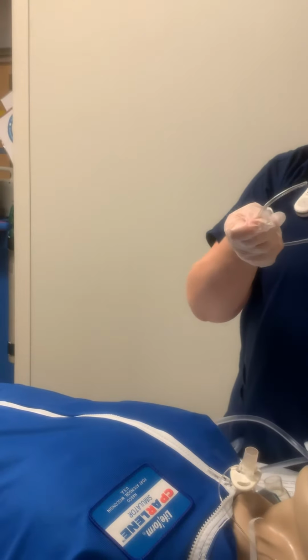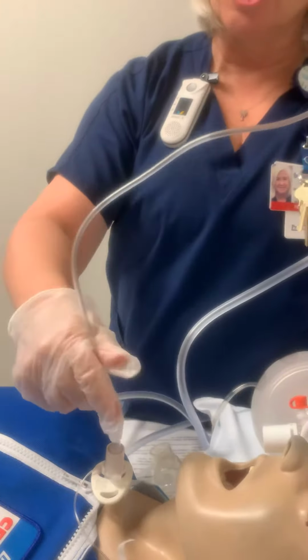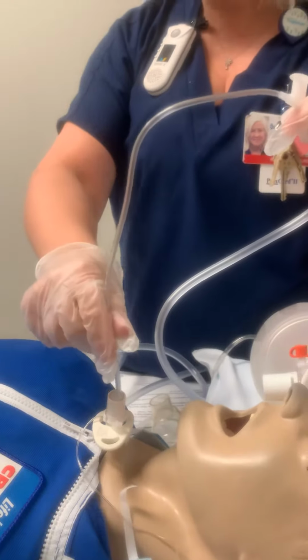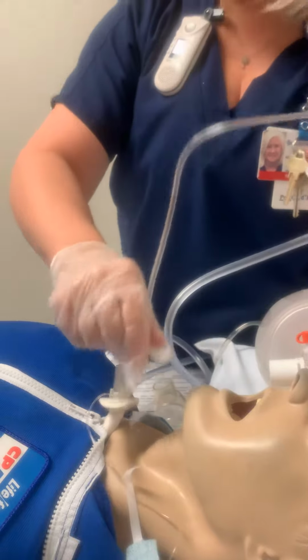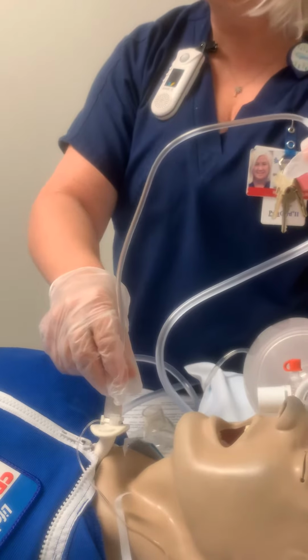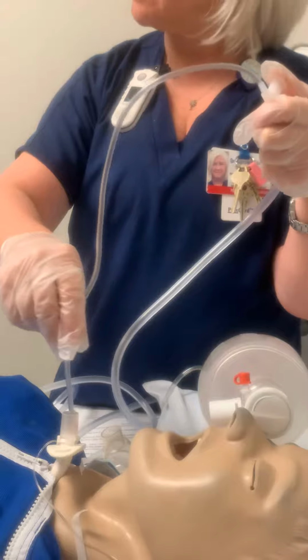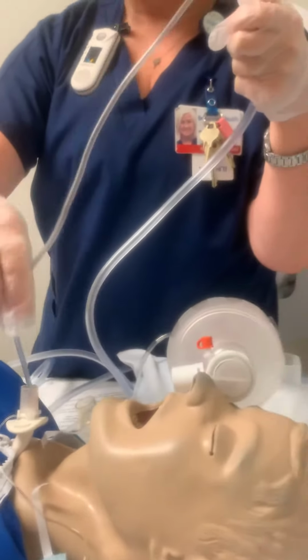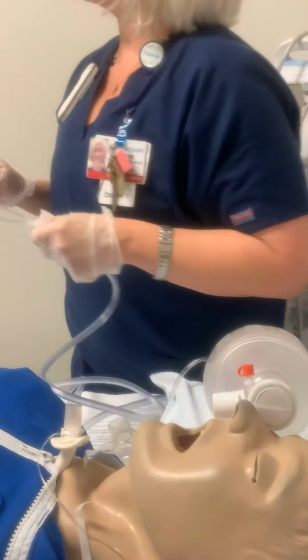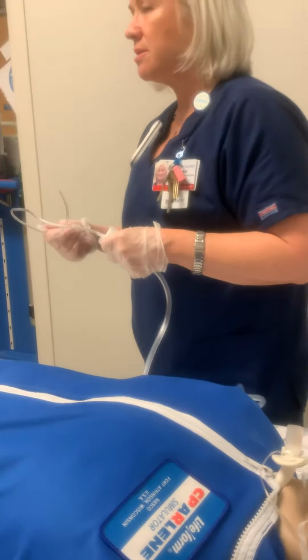And again, what is the max I can have this at? 150, okay? So I'm going to go in. Do not apply suction while you enter. Leave the fingers off the suction. You want to gently insert and don't be too aggressive. Now I've hit resistance. You don't want to keep shoving in, okay? Once you hit resistance, that's it. Pull it a smidgen back. Then I'm going to suction, and you can circle a little bit here and suction, and then bring it out. 15 seconds maximum. Because otherwise you're going to desat them too much.